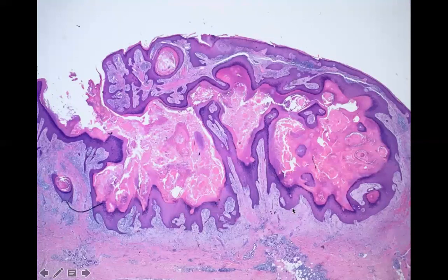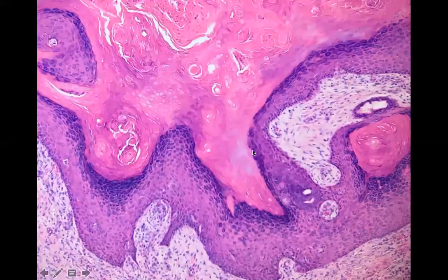This is when the lesion is fully regressing. You see this fibrosis all the way around. It's because lichenoid inflammation has gone and is eating it away and shrinking it inward. When it starts shrinking inward, look at your epithelium now. Now you've completely lost any of that glassy pink atypia. All of this has got a granular layer. You stop making parakeratosis. Now you're making orthokeratosis.